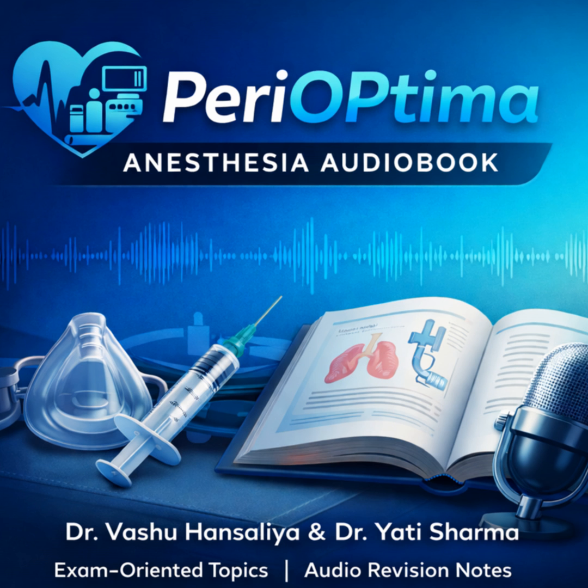Section 14, preoperative assessment in ECMO. If an ECMO patient comes to the OR, what are my top priorities? First, type. Is it VA or VV? This is the most important question.